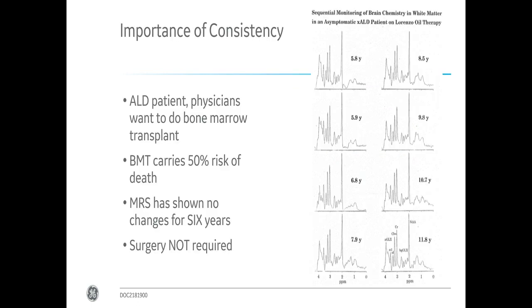I really want to come back to the importance of consistency in your protocol. So here's an example of a child with adrenoleukodystrophy with no symptoms, so asymptomatic.